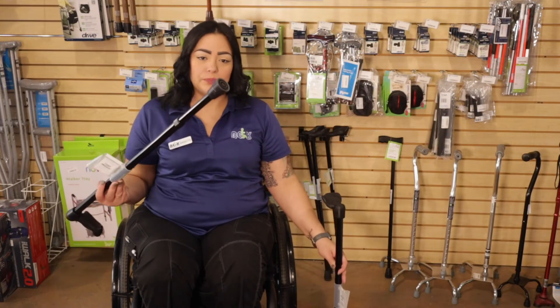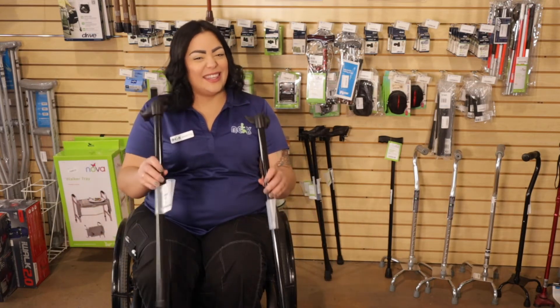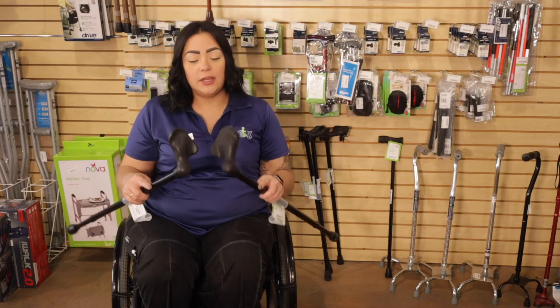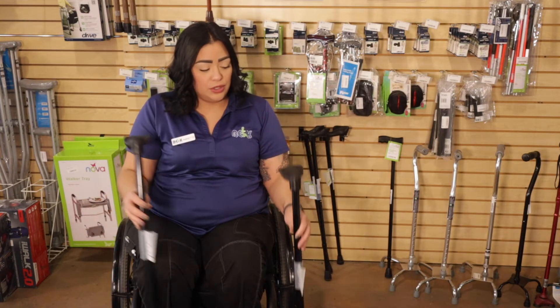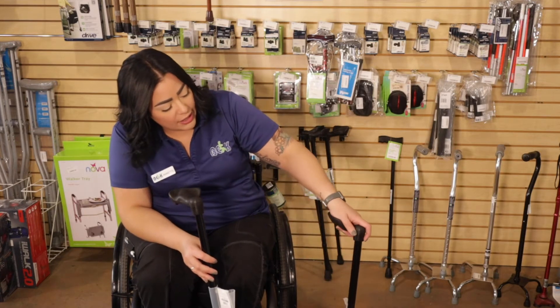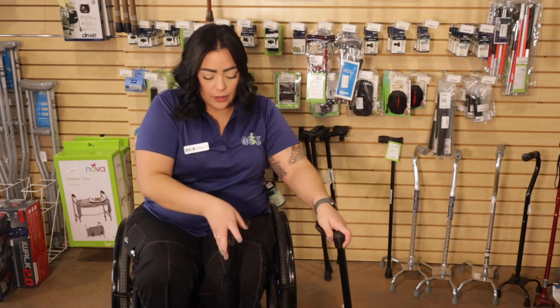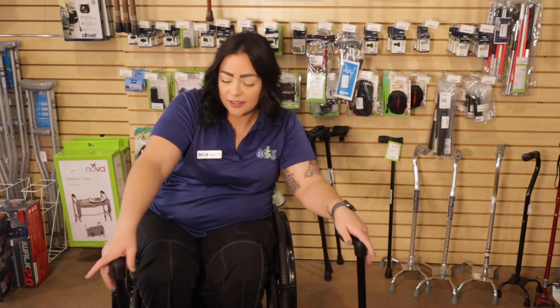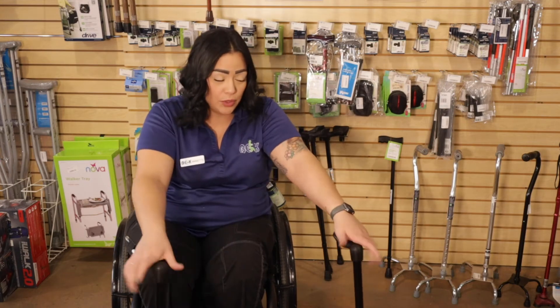All right, now let's talk about the one point. One point canes come in a lot of different styles as well, like these. These are actually made for either your left hand or your right hand, depending on your dominant hand or what feels more comfortable to you. These will hold your hand right at the thumb and the palm and will hug your hand right at that part, so it's a little bit more comfortable when you're using the cane.